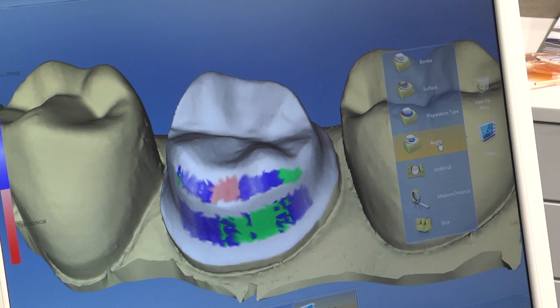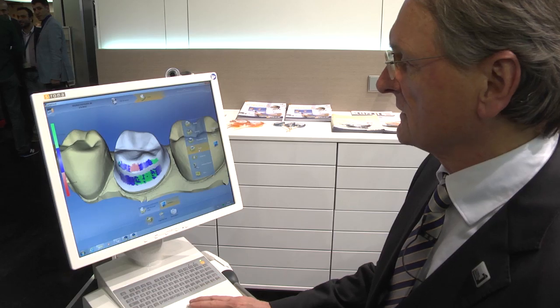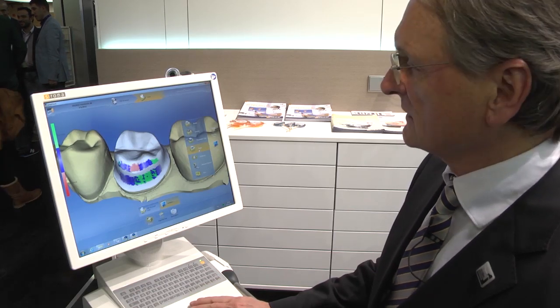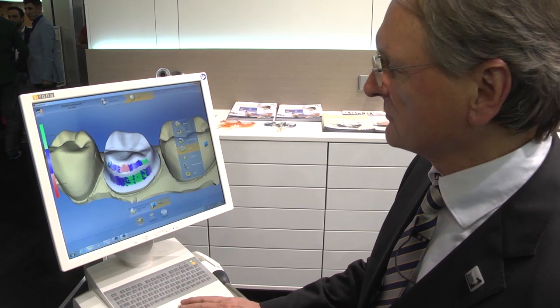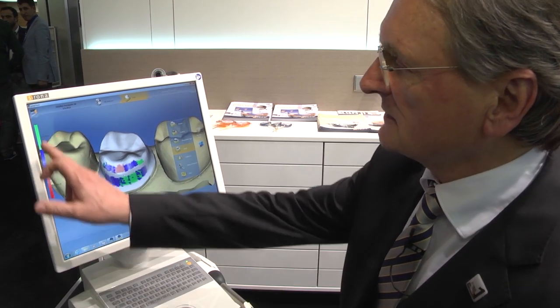We can go into the angle view and see what this crown preparation looks like. I see several colors — green, blue, and red. Green means too steep, which means I have to do some more work there. Blue is perfect. And if it's red, it's too conical.